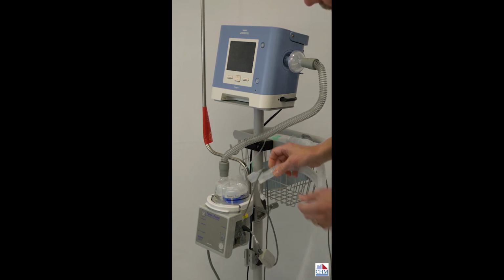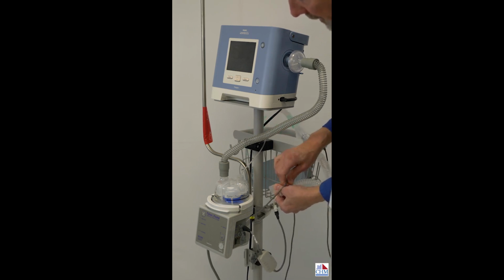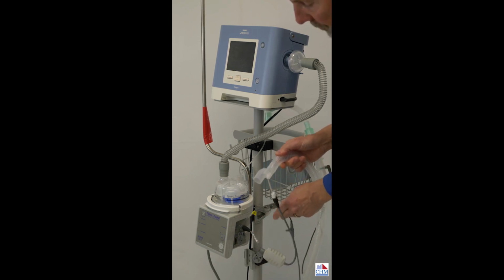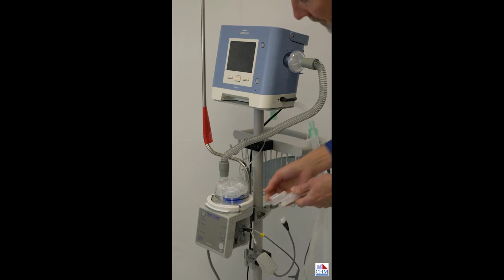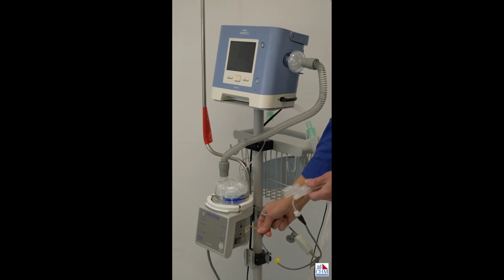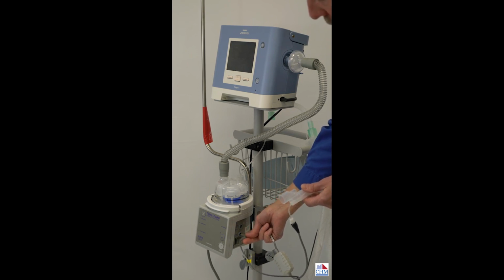Now you notice in the heated wire tube there is a probe attached here, and then there is also a heated wire adapter attached to the wire that's on the heated wire circuit, and both of them are plugged in to the side of the humidifier here. Nice thing about it, 2 different connectors, so we don't have to worry about which one goes where.